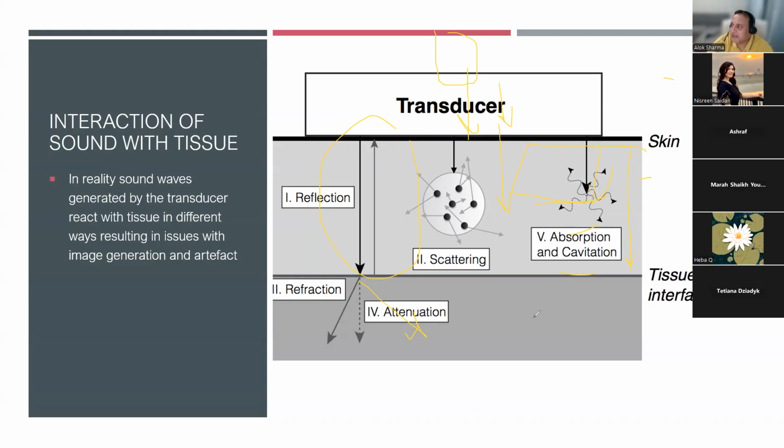A classical example that I will show you is in the lung, and I want you to look at me, guys. If this is your probe and you keep your probe at right angles, you are going to get the crispest images. But if your probe is kept laterally, then your sound waves are going to enter and reflect back at abnormal angles, but they're also going to refract more, because a transducing probe that's kept laterally is going to have sound waves coming in different directions, incident with tissue at different directions.